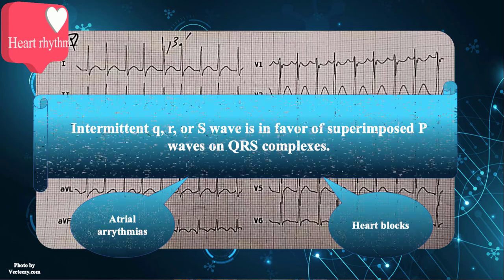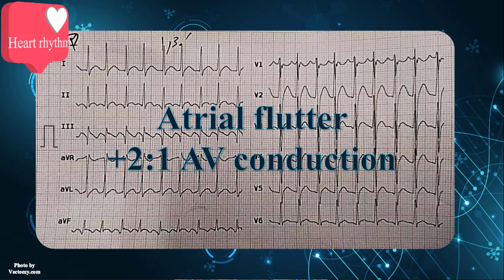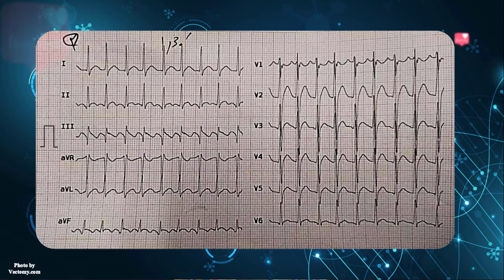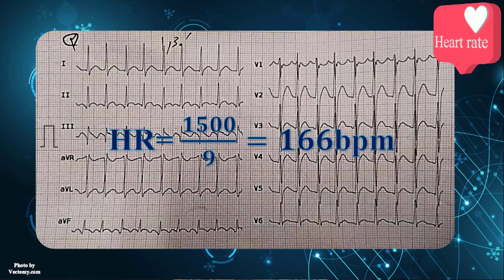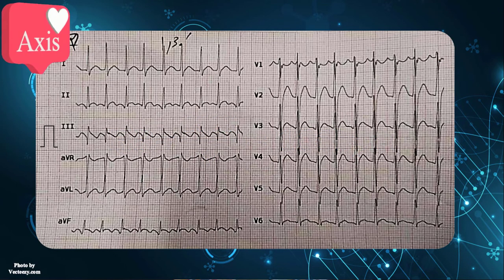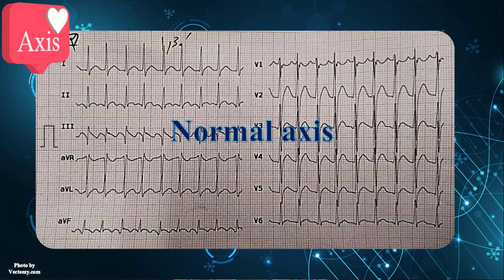In summary, the rhythm is atrial flutter with fixed 2-to-1 heart block. Next step is calculating heart rate. Since the RR intervals are stable and about 9 small boxes, the overall ventricular response is approximately 166 beats per minute. Then we should go through axis determination. QRS complexes are positive in both leads 1 and 2, thereby the axis is normal.